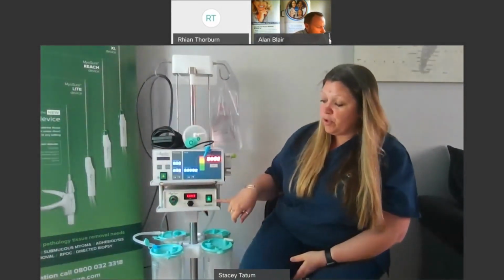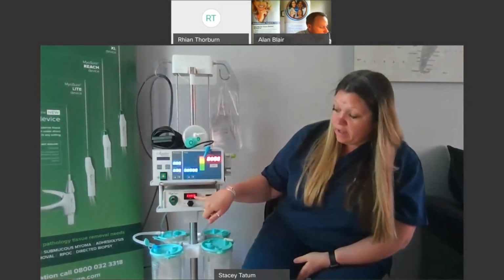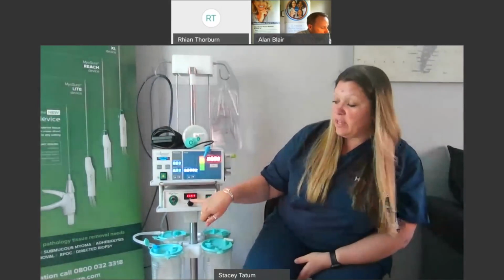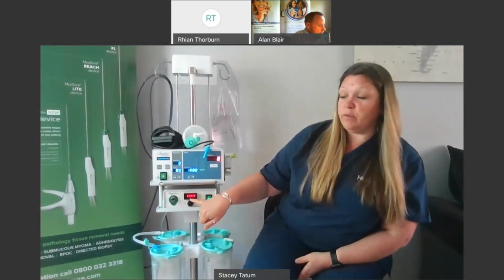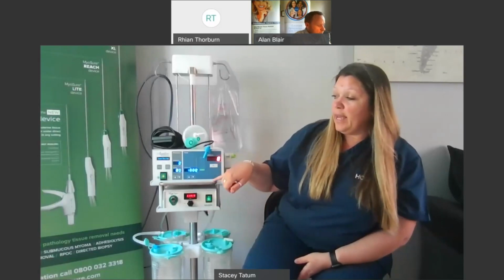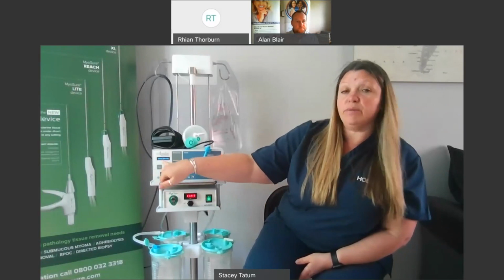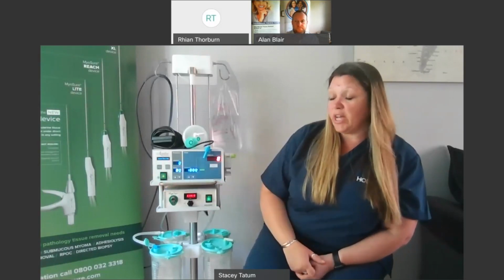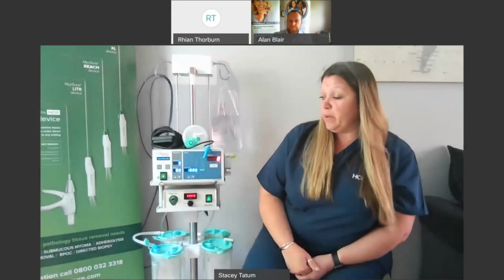You have the MyoSure controller, which is a simple on-off switch here. Some lights will come on, some numbers. They should all be 0. If they're not, there's a little grey key here. We just 0 those out. And the Aquilex, it will do a little systems check. It will tell you what it's doing in this window here. So it will say system check, system OK, and then it will ask you to insert your tubing.